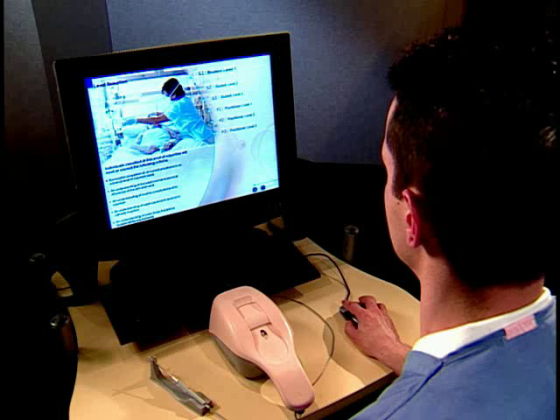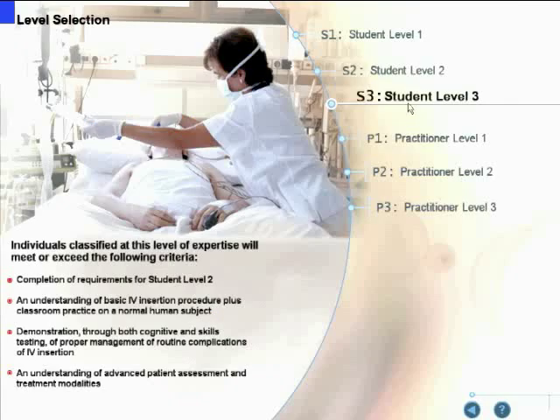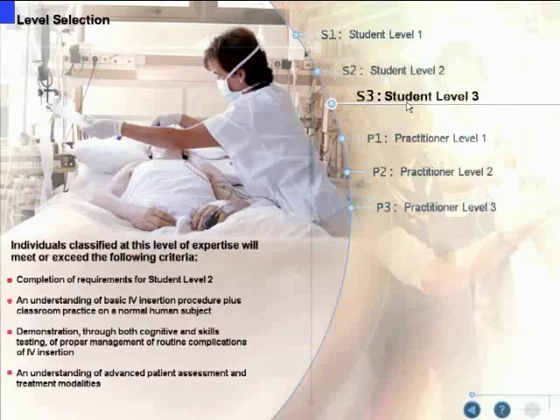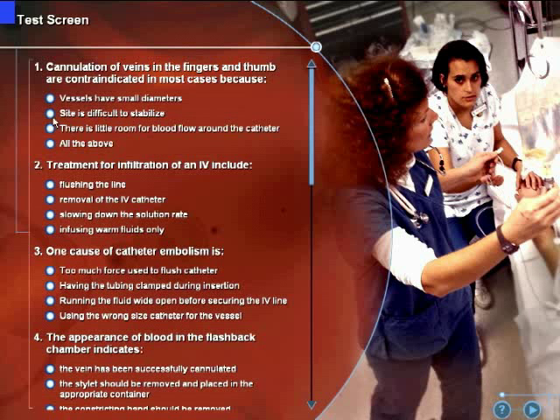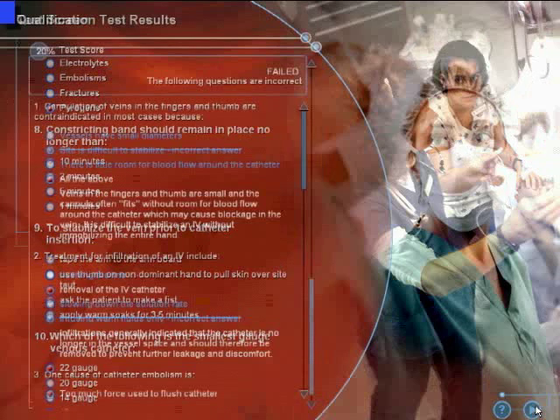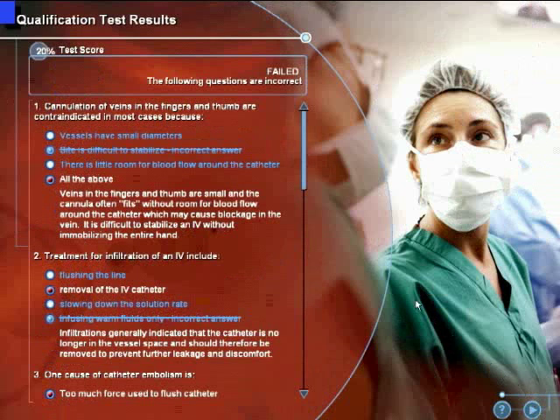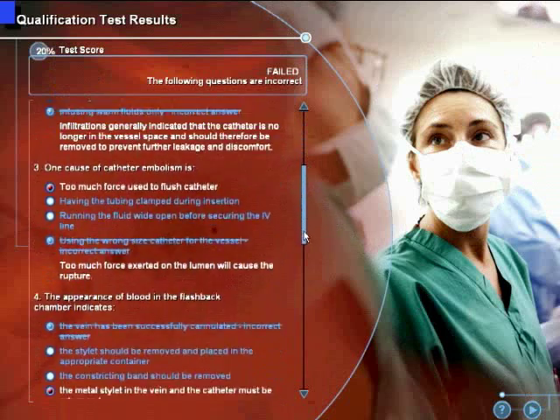If this is your first time in career mode, you will be asked to choose your initial level of competency. Choose the skill level that most closely matches your competency. If you choose a skill level above S1, you will be transitioned to a qualifying test which you will need to pass to begin training at this level. Answer all 10 questions and advance to the next screen.